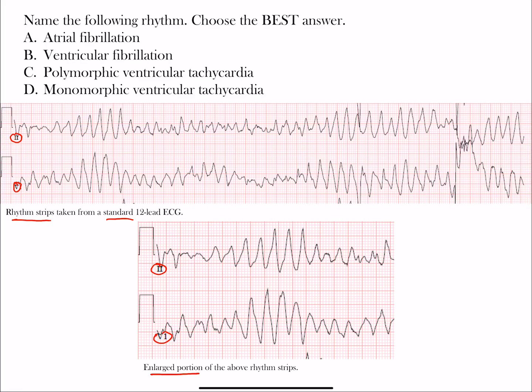Let's look at the question: name the following rhythm and choose the best answer. Choice A is atrial fibrillation, B is ventricular fibrillation, C is polymorphic ventricular tachycardia or torsades, and D is monomorphic ventricular tachycardia. So pause the video, take a chance to go through them yourself, choose an answer, and then we'll go through this together.